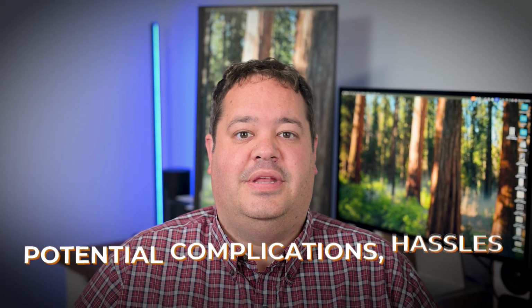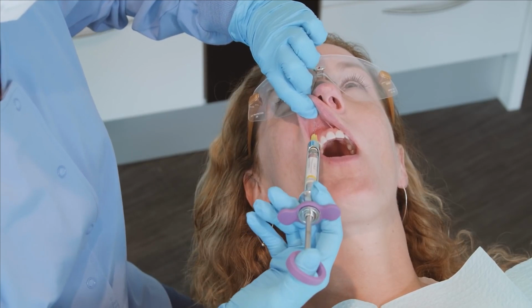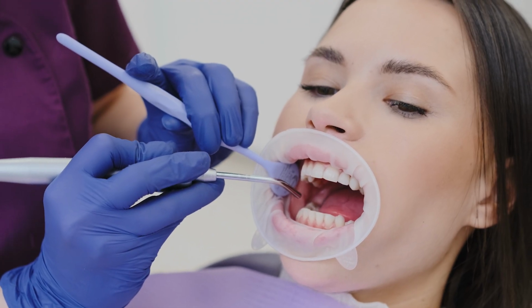I've tried it, and the potential complications, hassles, and training, I'm not sure it makes enough of a difference for me to do it. Teach your assistant where and how you will inject, and then teach them to dry and place topical appropriately. It really should not be a big deal.